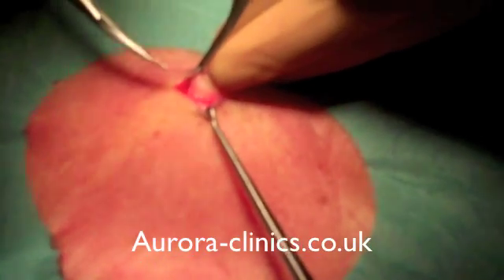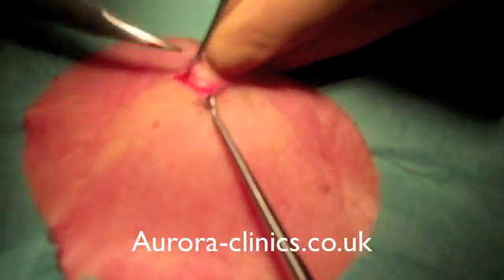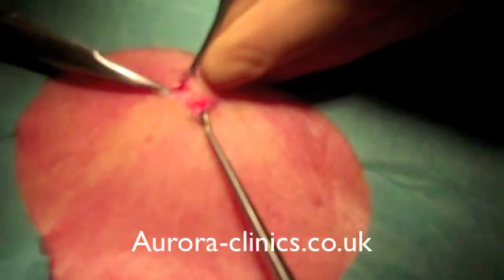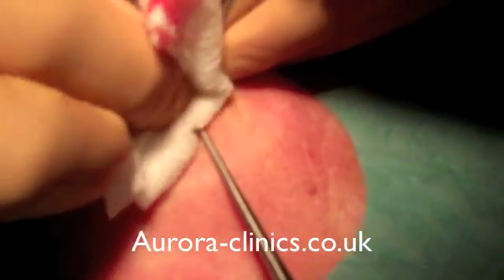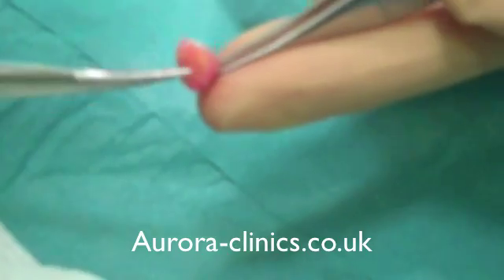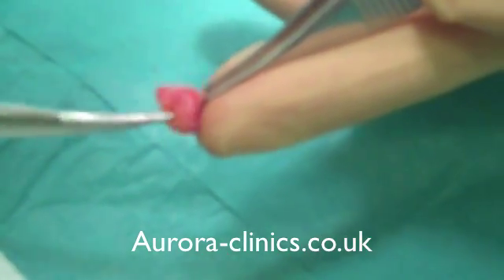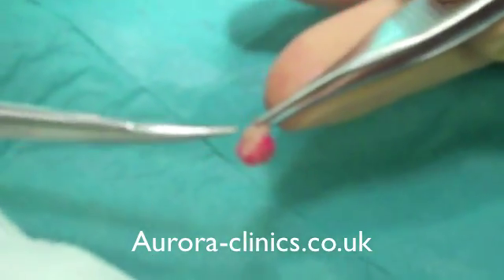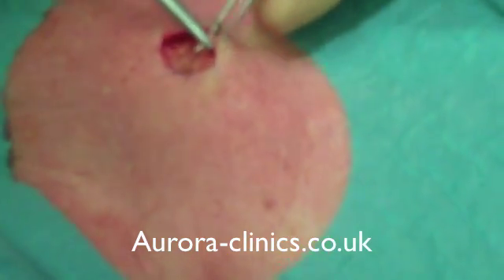Then you should be able to just work gently around and get the cyst out. Now this cyst has been infected — you can see there, unfortunately I've just burst it. But it's important, even if you do burst it, to try and get all the layer of the cyst out with the overlying skin ellipse.